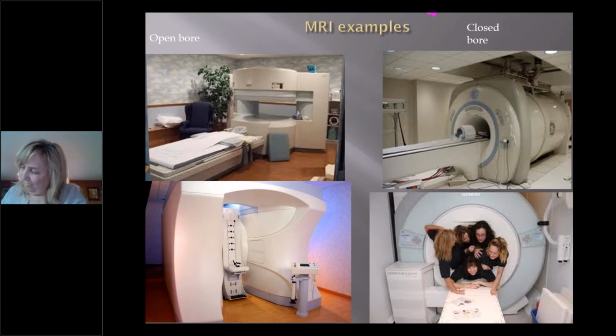But if you have a patient that is so obese that they can't fit in a magnet, or so claustrophobic that they won't do the magnet even with some happy juice, i.e. Valium or Xanax or something, that may be an option for you. I've only had a handful of people who just said, no way, can't do any of that, and they adamantly request propofol sedation, which is a real nightmare. Most hospitals hate it because they've got to have an anesthesia doc or a CRNA come down, give them some propofol and monitor them and yada yada. But that's a very limited scenario.